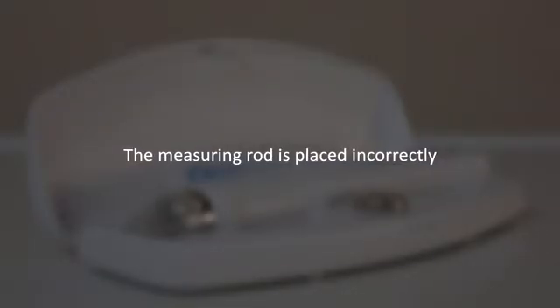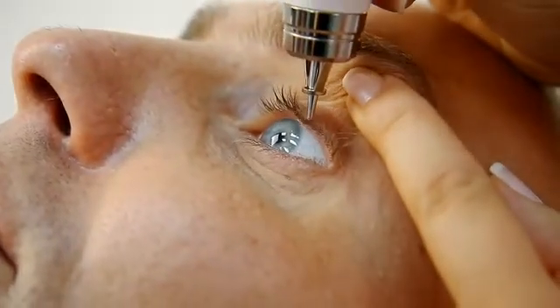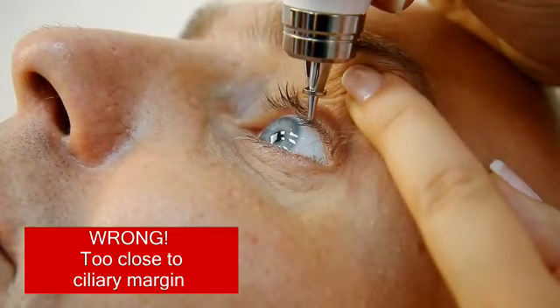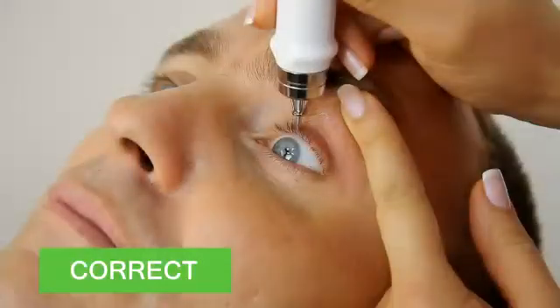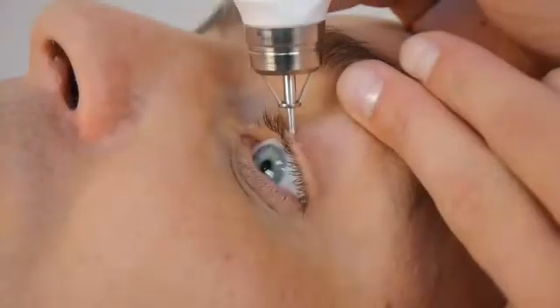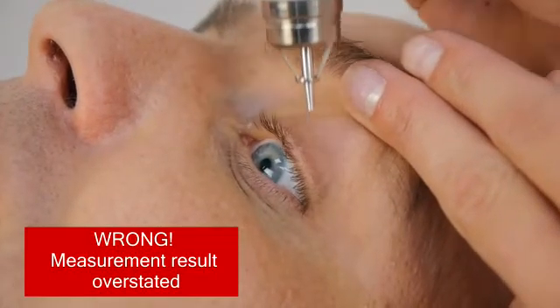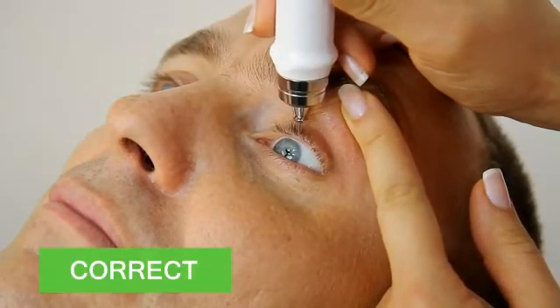The measuring rod is placed incorrectly. The tonometer rod should not be too close to the ciliary margin or too far apart from it. The rod is sliding along the eyelid. The rod must not slide along the eyelid during measurement. The tip of the rod should be fixed. The rod must move only up or down.